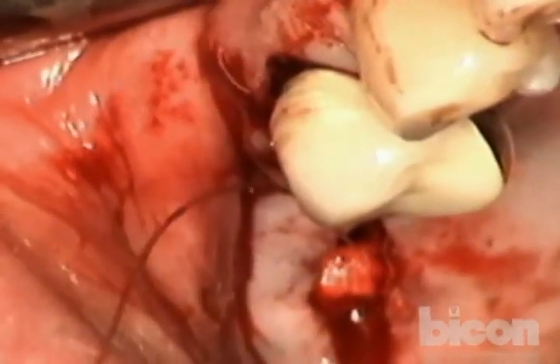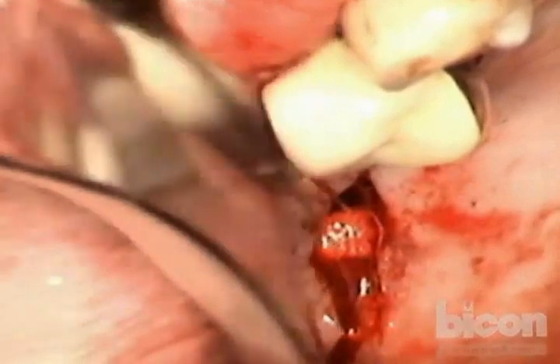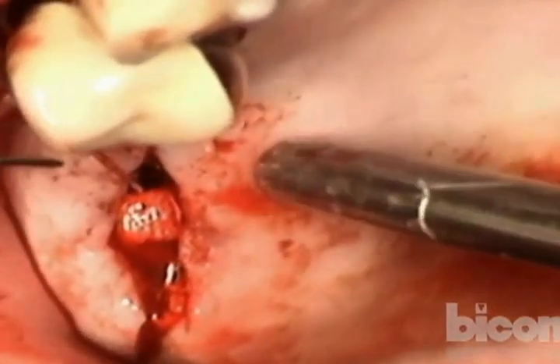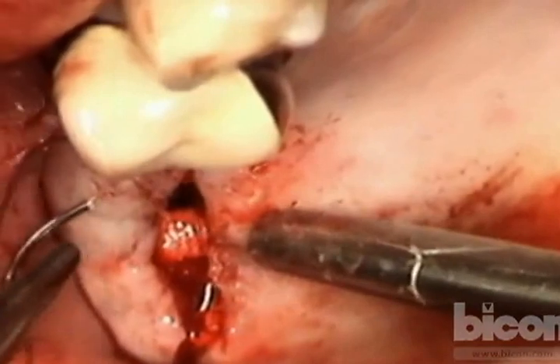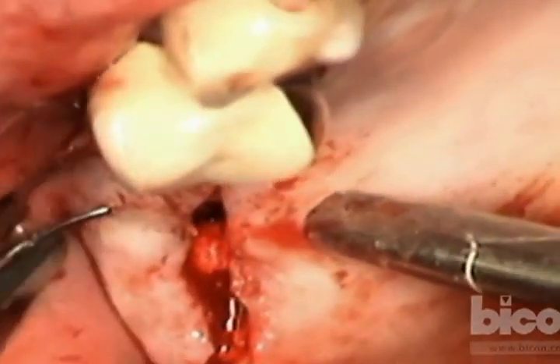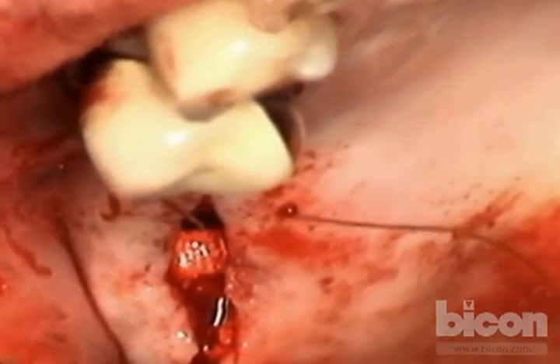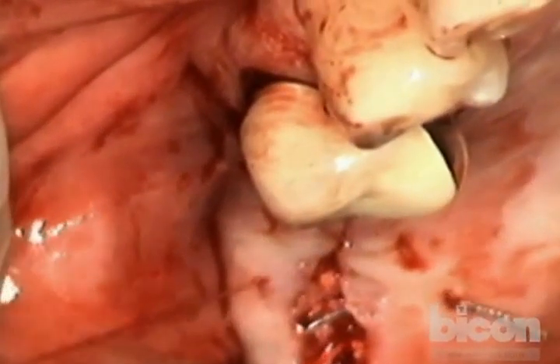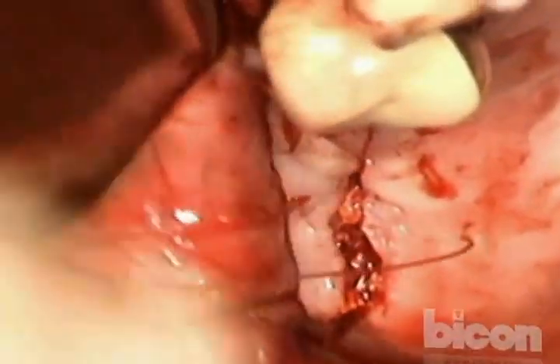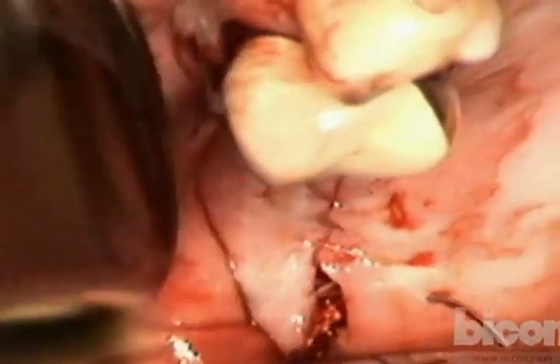All right, and then we will reinforce the releasing incision. Okay, I'm going to go to another retraction device here. Good. Great. Continuous baseball type running suture, because I don't need the eversion in this end because there's no abutment to cover. Okay, and that will give us good coverage. Go back deeper. Right. Good.